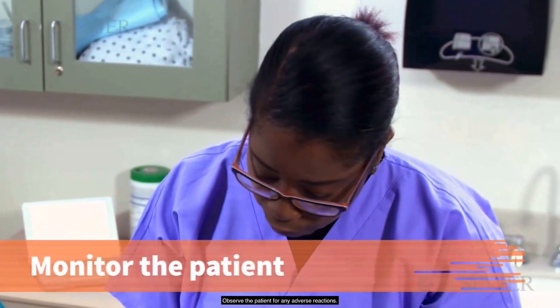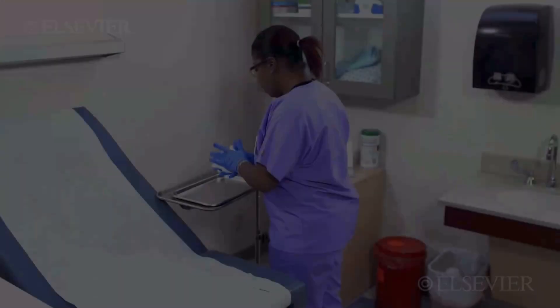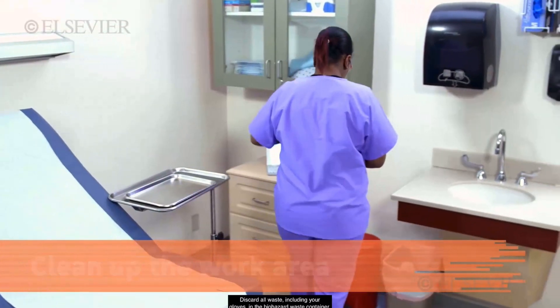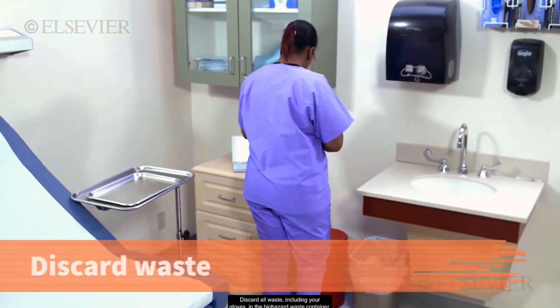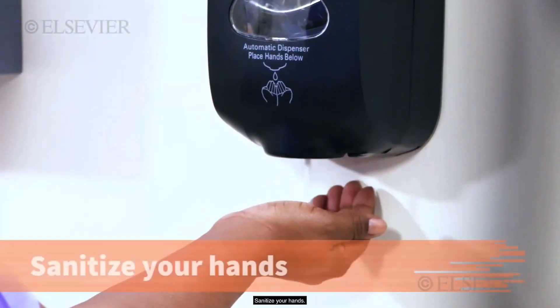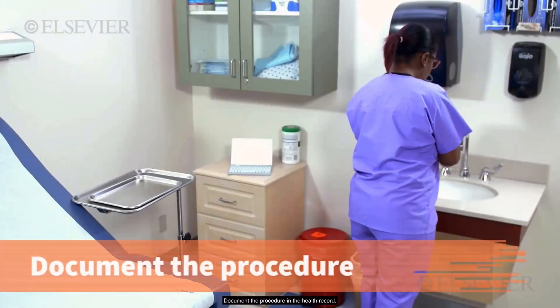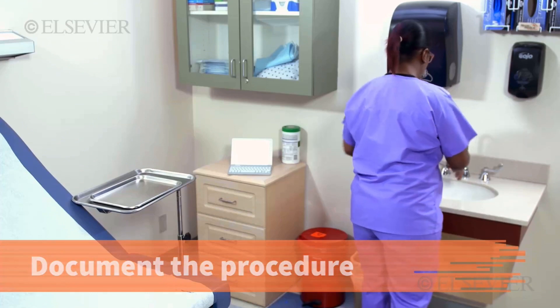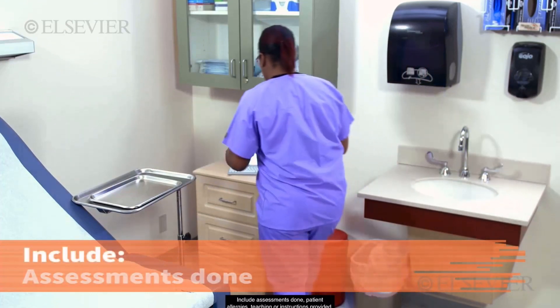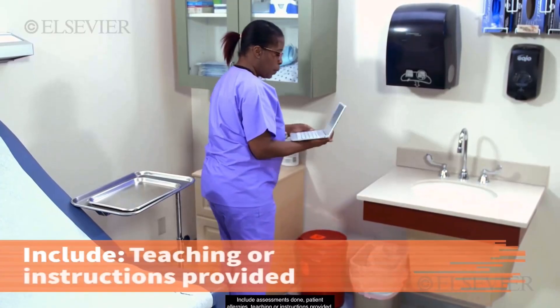Observe the patient for any adverse reactions. Clean up the area and discard all waste, including your gloves, in the biohazard waste container. Sanitize your hands. Document the procedure in the health record, including assessments done, patient allergies, and teaching or instructions provided.